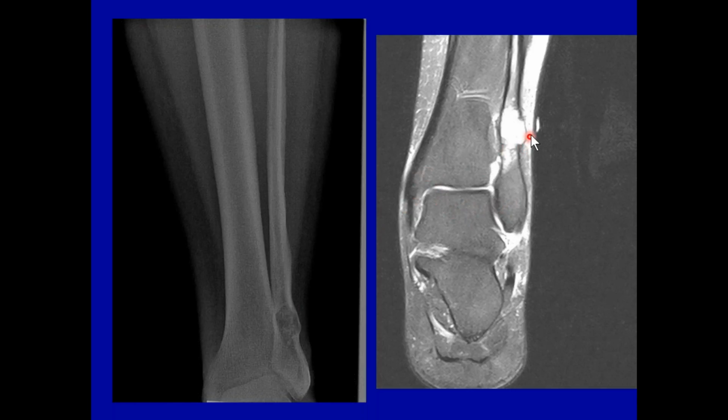So we have a lesion that is expanding the fibula, the cortex, the shell of the egg will break. The orthopedist has to do something, probably go in, clean this all out, but there's more of the lesion inferior to this parent portion. And then he has to decide, do I put on a cortical plate because I can't have the cortex being weakened? It needs surgical intervention. So on the MRI examination, this is a marker that they put on, telling them which is the important part of the fibula.